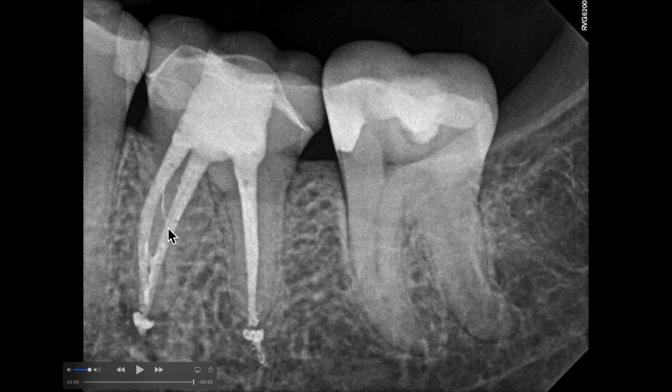And I do believe it matters, because I have a lesion down here. And then when I get into the apical third, it's arguable that there may be isthmus up that whole apical third. And I can see some dent in here and here, but for the most part, that communicates all the way up. And then voila, there you go. That's my justification and rationale why the GentleWave needs to be done on retreatments. And you see some sealer extrusion. With bioceramics, you hope that it goes away.